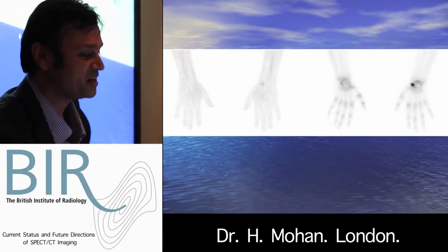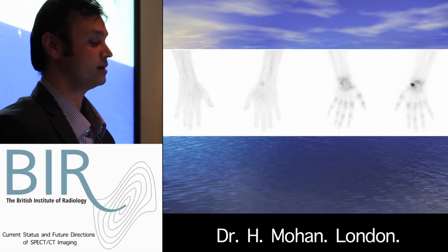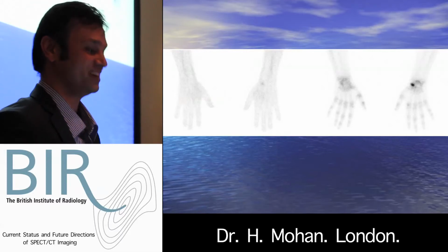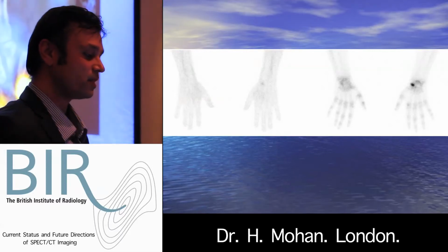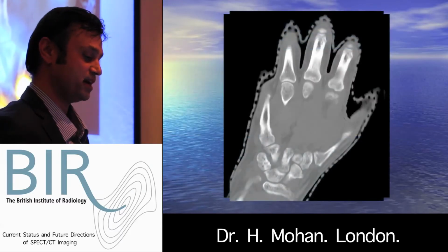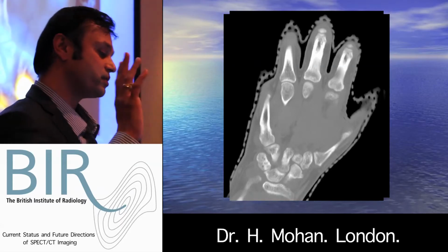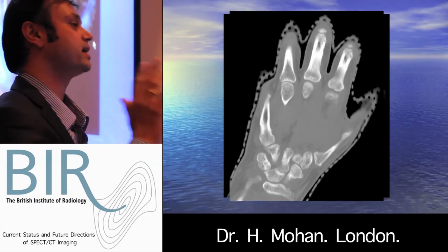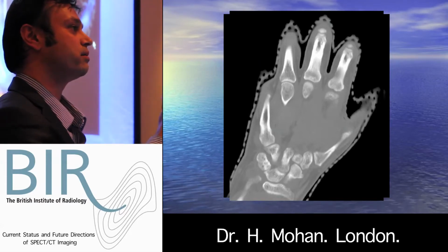And then a further patient who had, once again, we seem to get a lot of left-sided problems. Almost all of my cases seem to be left-sided. Anyway, this patient had uptake in the radial aspect. Now, one of the problems which we have found is, even with SPECT CT being done in a single setting, the problems of movement still remain.